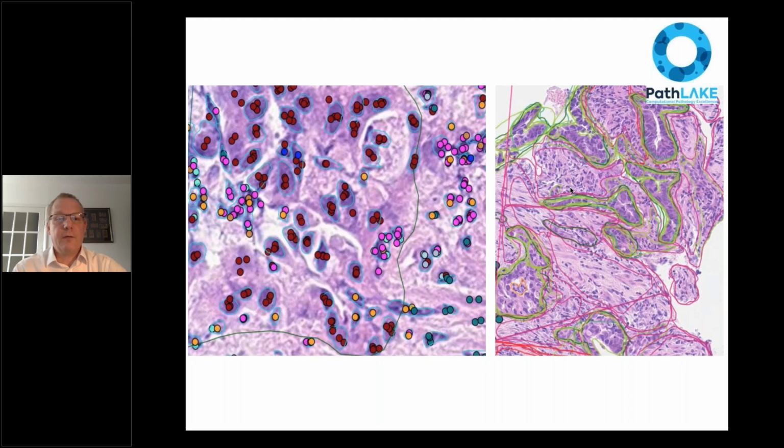And each of the dots represents one individual pathologist's view as to what that particular cell is. In this case, this is cell level annotation. All of the cells in the patch that we've highlighted need to be labelled by each of the pathologists. So we get 3 versions of the truth as to what each of those cells is. And you can see that there is very good agreement between pathologists as to what represents carcinoma cells, and slightly less good agreement about what all the other cells are in the background.